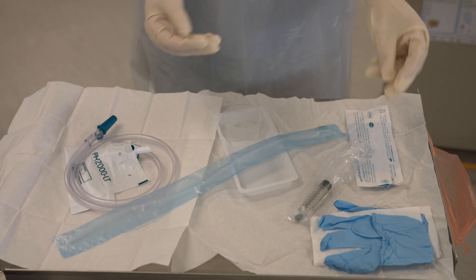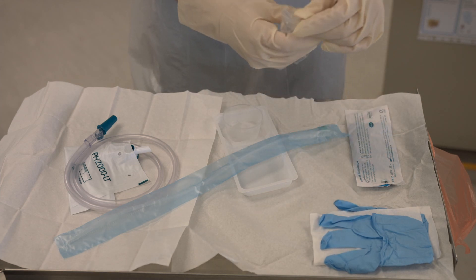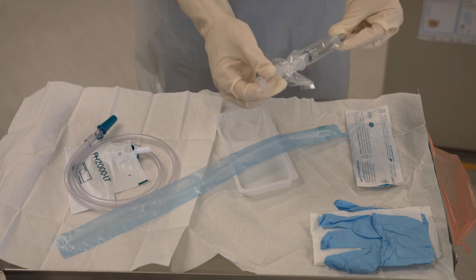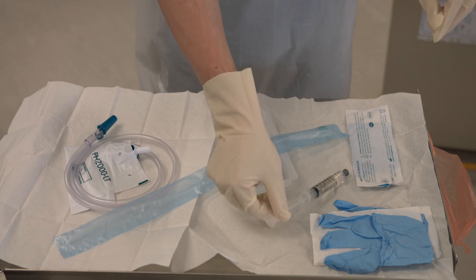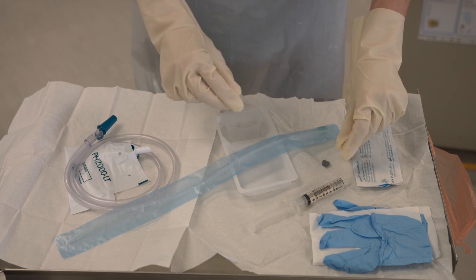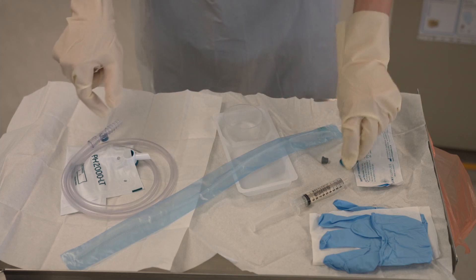You may now touch your sterile field. First, open the package and take off the cap for the water for inflation of the balloon. Next, take the cap off the catheter bag.